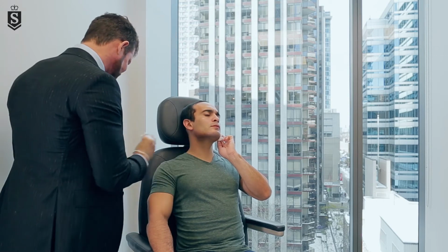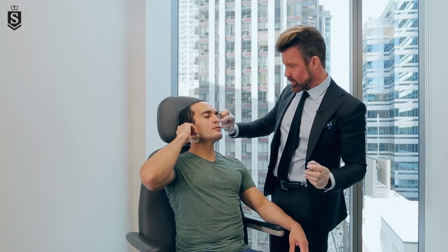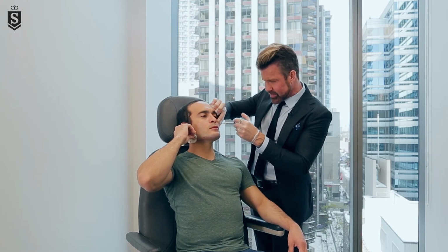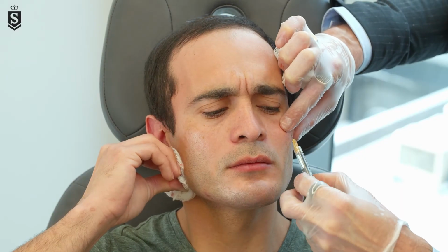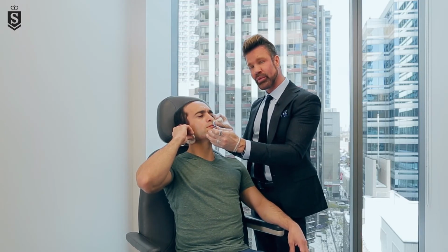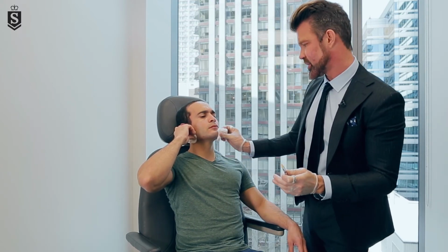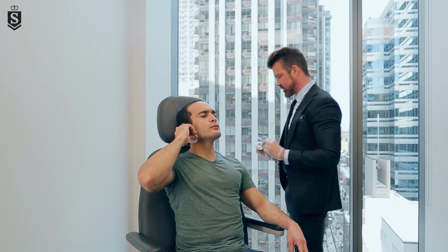Very masculinizing feature. So another masculinizing feature is just to give a little bit more squareness and definition to the cheekbone here without rounding out. So we're going to add a little bit right onto the prominence of the zygoma and right on the bone in this case. And we don't need a lot in this case. We don't need to overdo it. But here we're using product or filler to create contours, to create shape. You can see one side to the other already. It has a nice effect.